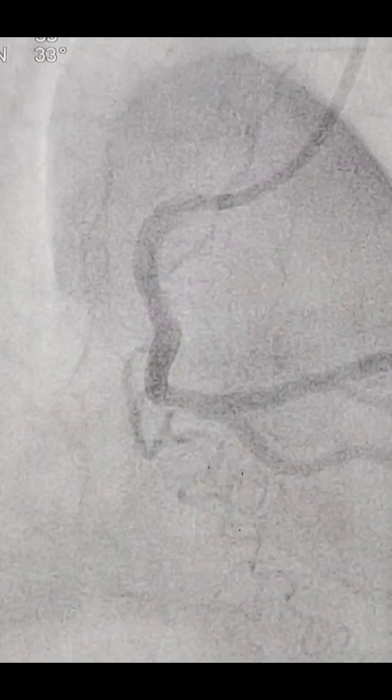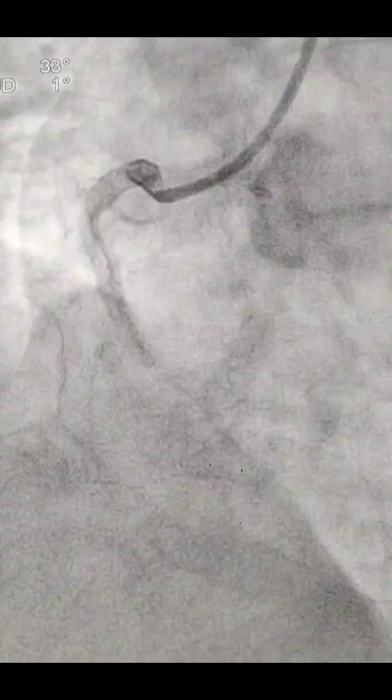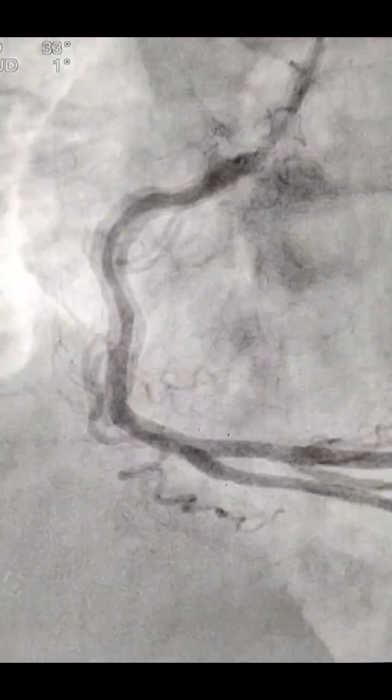There was a bend, and because of that bend we felt that it was an aneurysm or under deployment, but that looks good now. TIMI 3 flow is there. This is a cranial view, and this is the final LAO shot. You can see how large and super dominant the RCA is. This was a primary angioplasty to the RCA and PLVB.